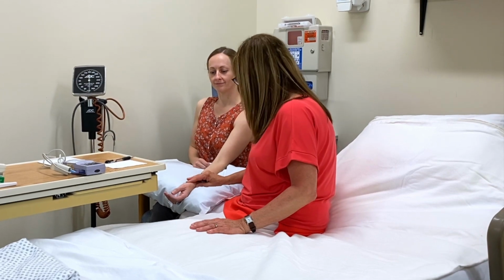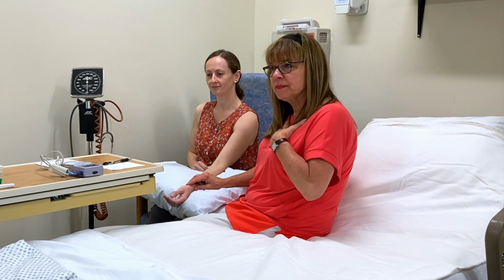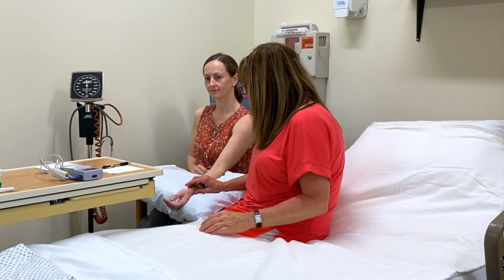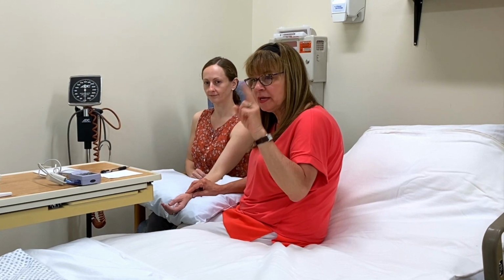Some breathing action. Okay. And you're going to count respiration. 1 respiration equals 1 inhalation, 1 exhalation. So I'm going to count for 30 seconds again and multiply by 2.